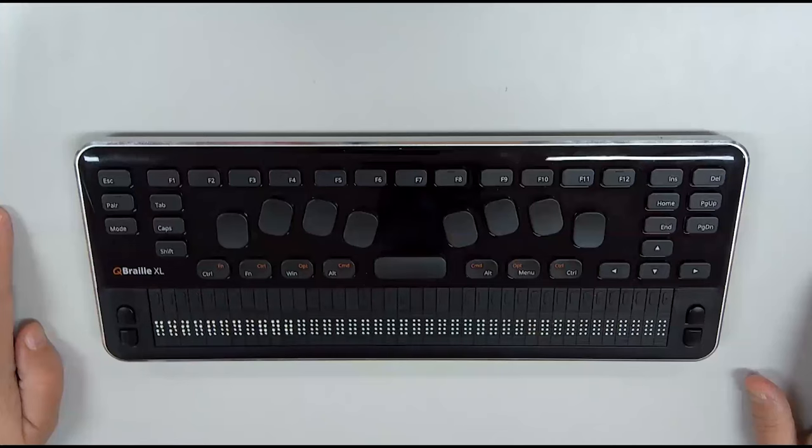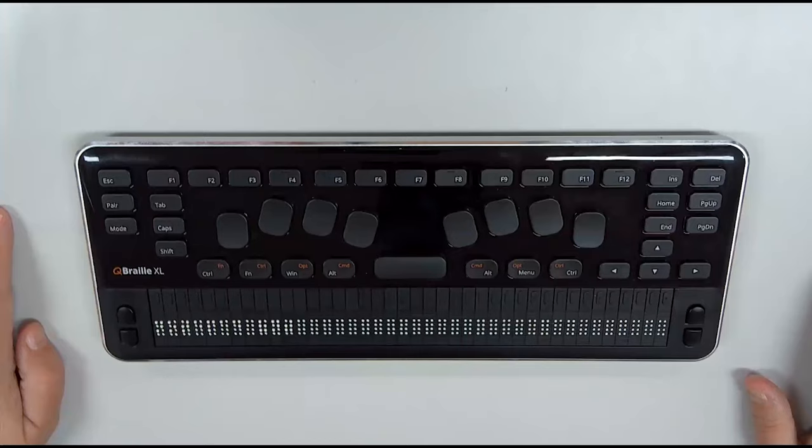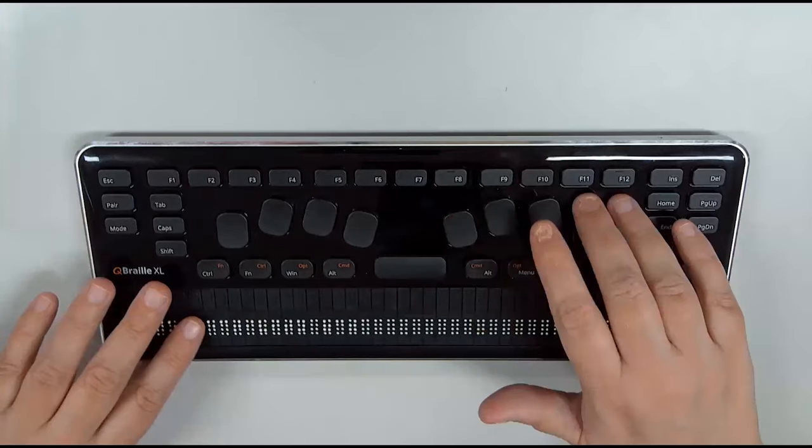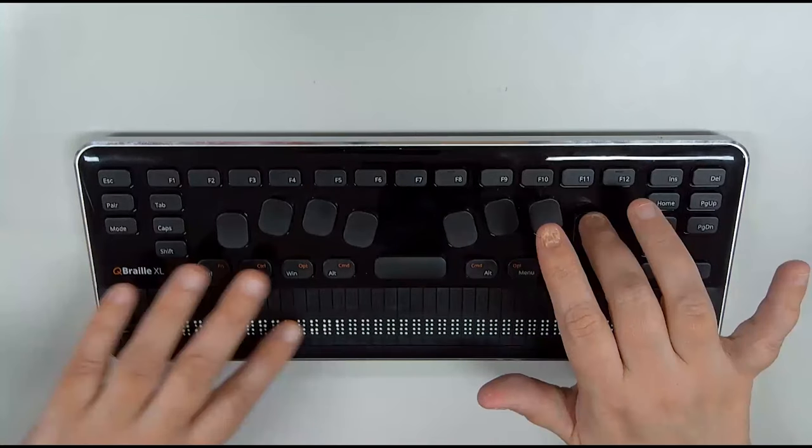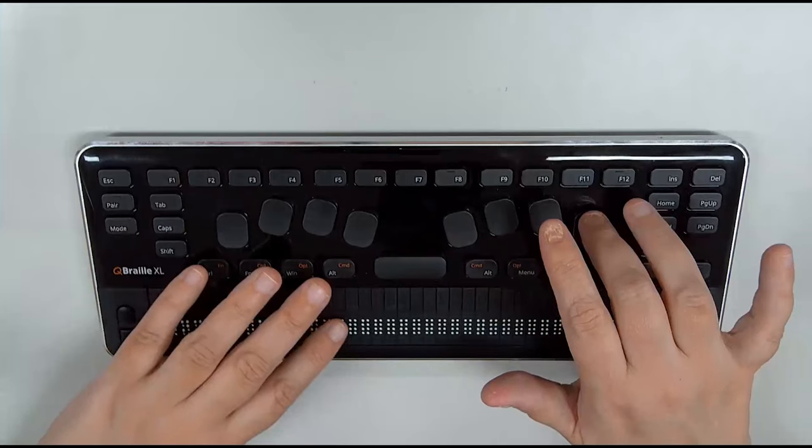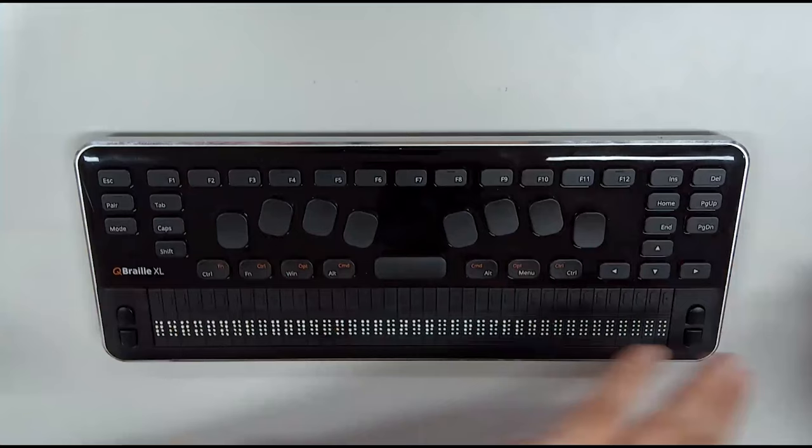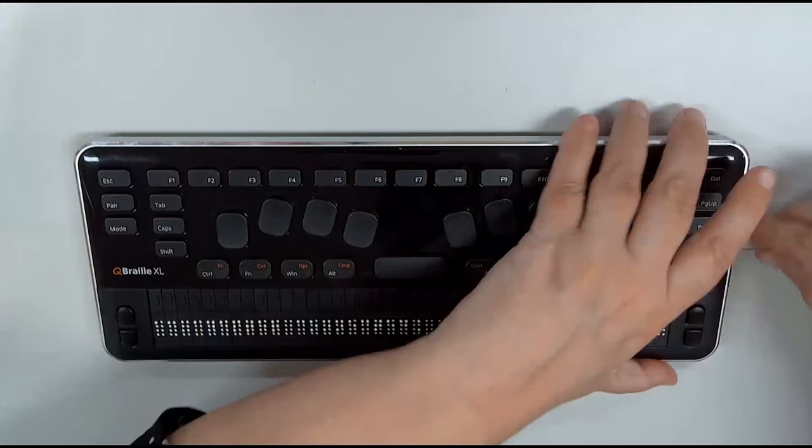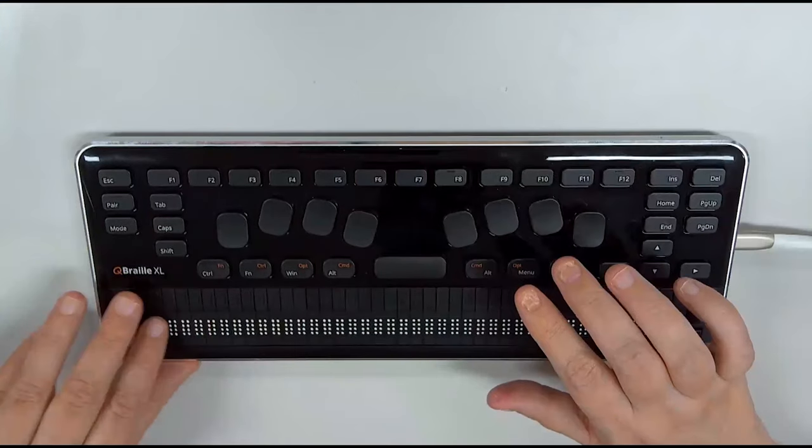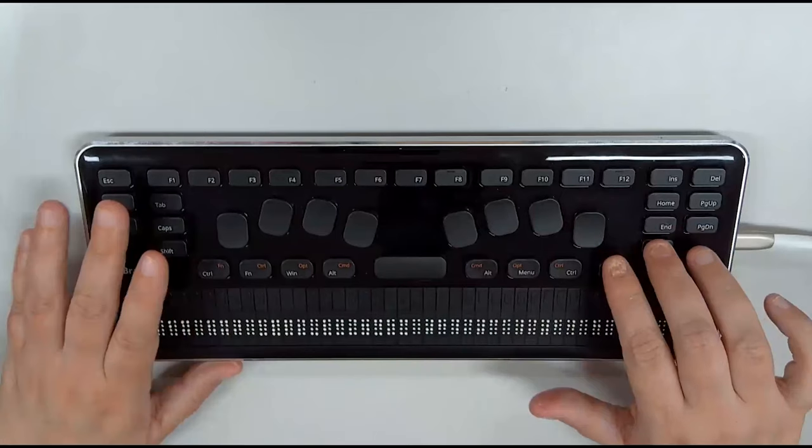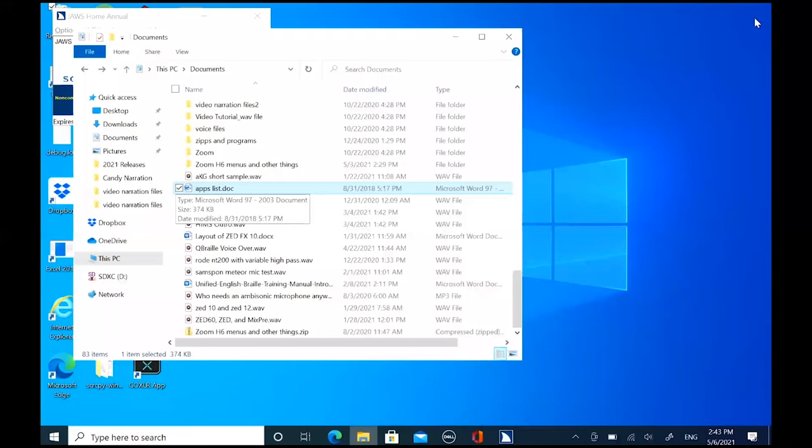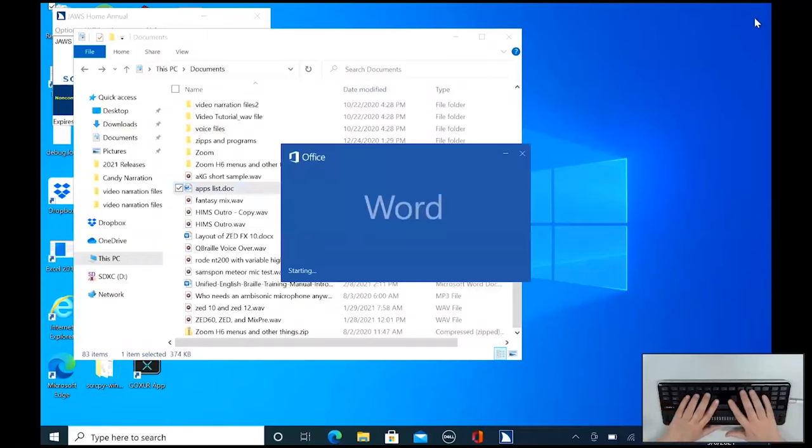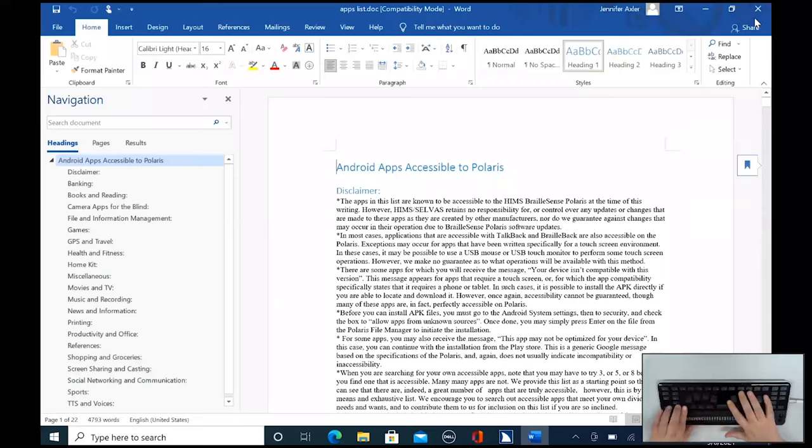In this video, we're going to take a quick look at the advantages of the hybrid keyboard. In order to do that, I'm going to connect to my PC. So the first thing I need to do from the Q Braille main menu is to go to Connectivity. I'm going to press Enter, and I'm given my list of connection types. The first one is USB, so I will press Enter again to enter USB terminal mode. Once I'm in terminal mode, I can then connect to my PC. I already have the other end of this cable connected to the PC, and now you can hear things happening. And as I use the arrow keys, things are now happening on my PC. So I'm actually going to open this document, so I'll press Enter here.